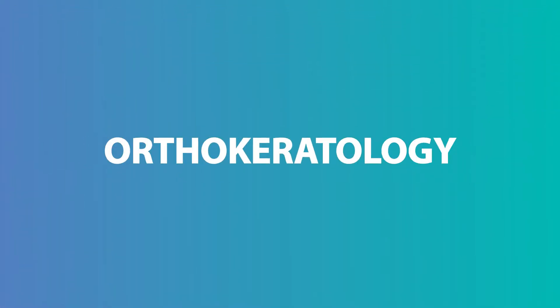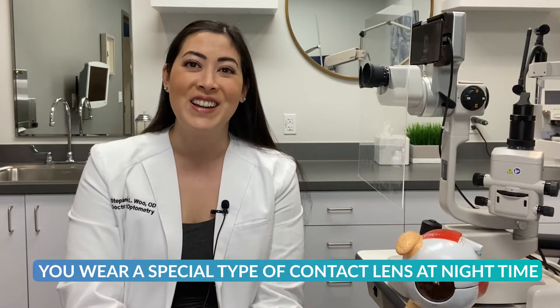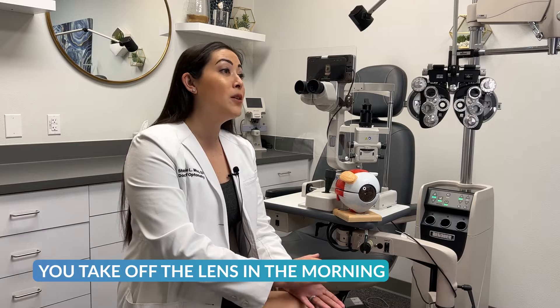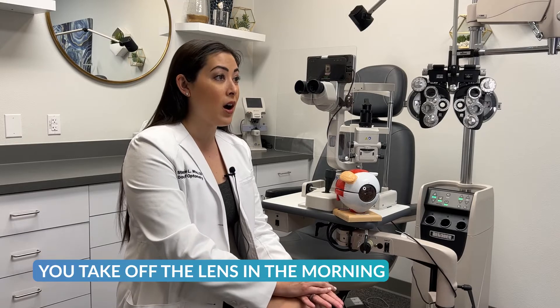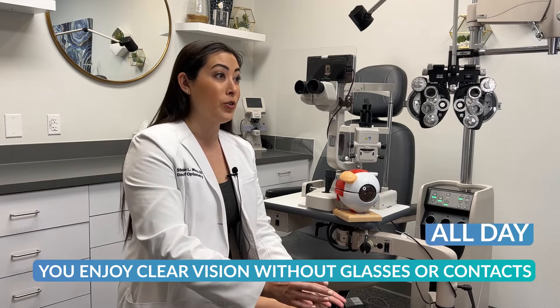What is orthokeratology? You may have learned in optometry school the basics of orthokeratology, but the premise is you wear a special type of contact lens at nighttime and it reshapes the front of the eye. In the morning you take the lens off and you enjoy clear vision without glasses or contacts all day.